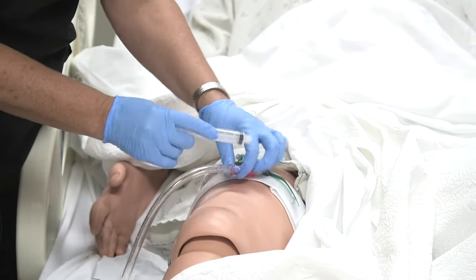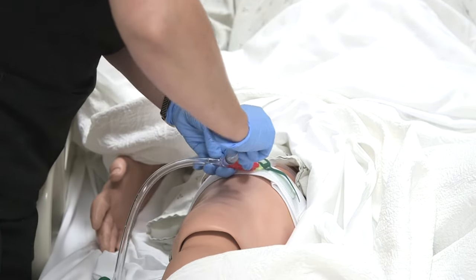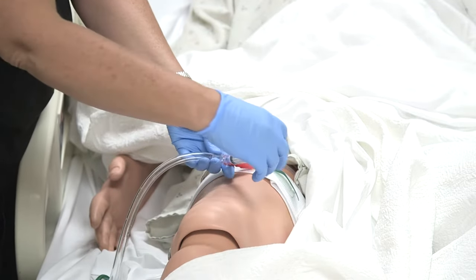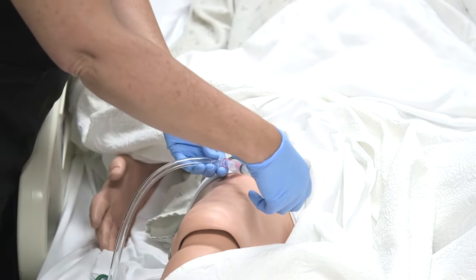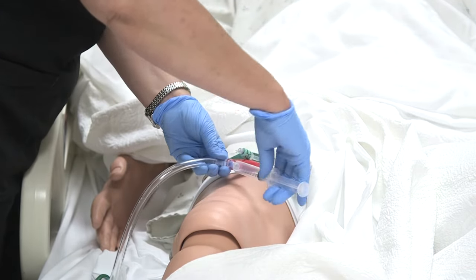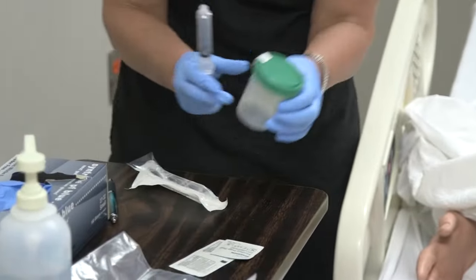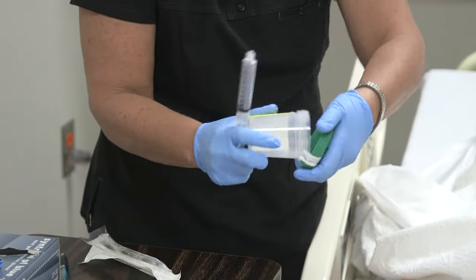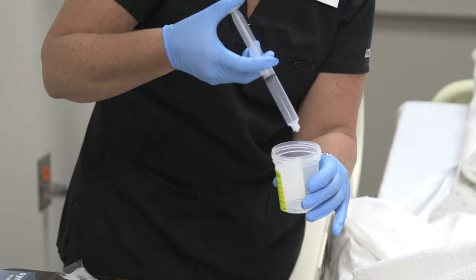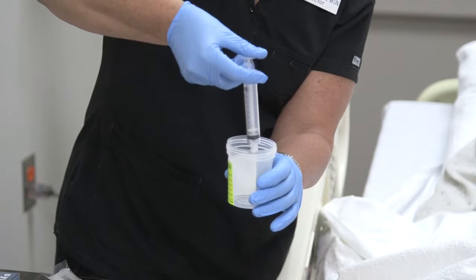We're going to put the syringe right on the port. It's a luer lock, so you have to push in, turn, and twist it. Then draw up the amount that you want. We're not going to get a lot of urine right now because we're on a mannequin, but once you draw up your 10 cc's, keep the tip sterile — don't touch it on anything. Open your container, put the cover upright, and as you're putting the urine in, do not touch anything. Put it right in the middle so you don't contaminate.